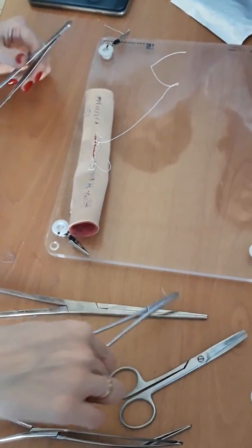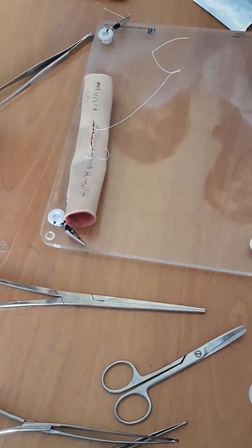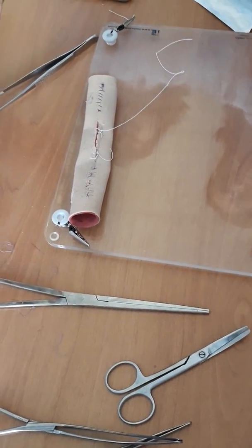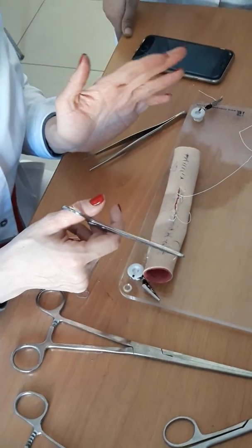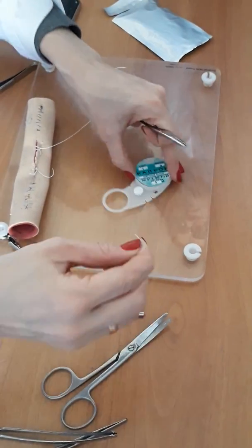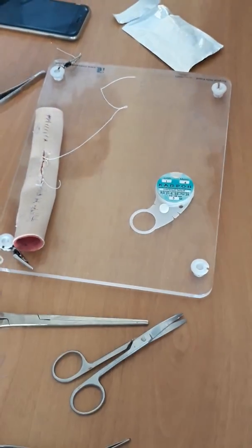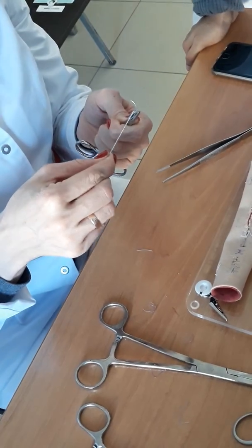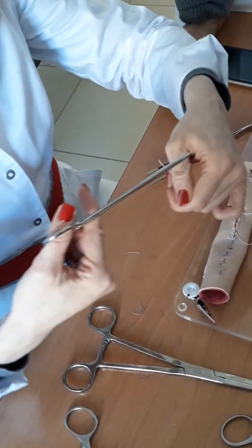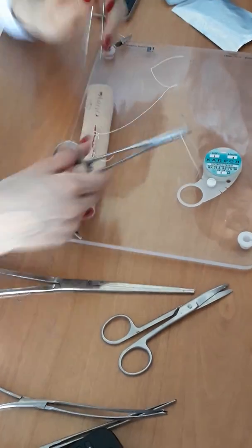After that, the non-penetrate suturing is used, and I will demonstrate non-penetrate suturing, Lembert suturing. Lembert suturing may be interrupted and may be continuous. If you make interrupted, the length of the filament should be 10 centimeters, not more. And I will demonstrate how you should make a Lembert suturing. You should pierce only serosa and muscles. Look please.